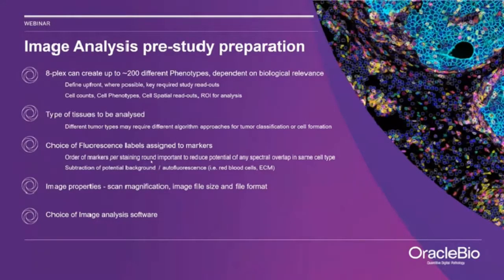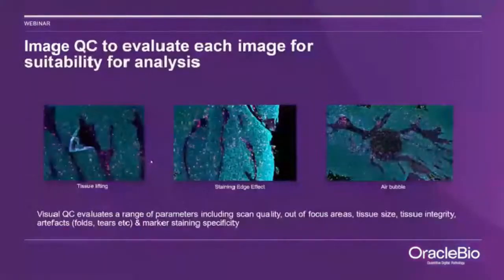From our perspective, we find it useful to be able to select a software that best supports a particular analysis approach and generation of readouts aligned to the samples that we receive. And we do this on a study-by-study basis. Alternatively, our client may request us to align the analysis we perform with the software they utilize in-house, and this can be a decision in the software we choose. For the analysis I'm showing today, we will use the Visiopharm platform.